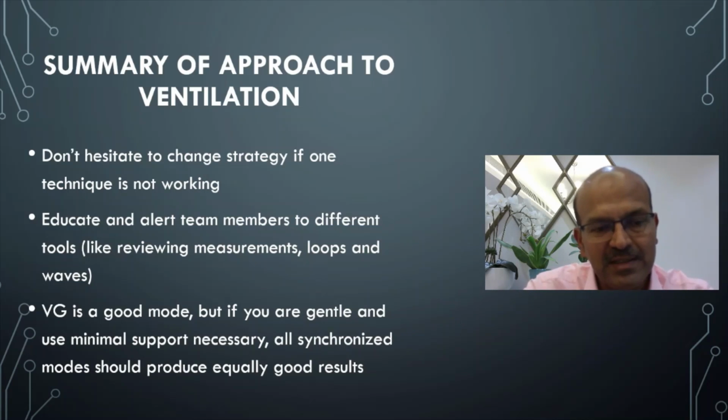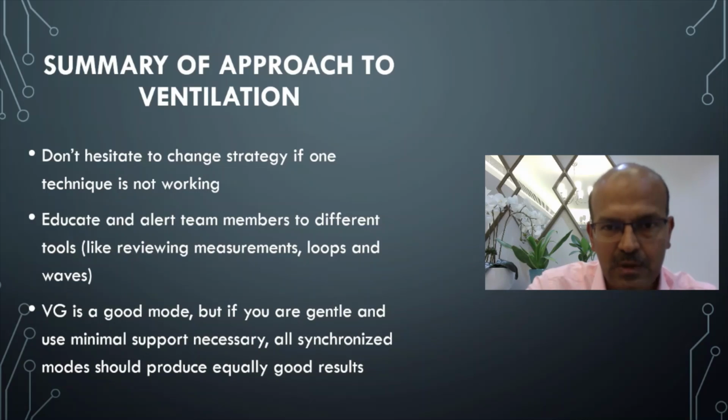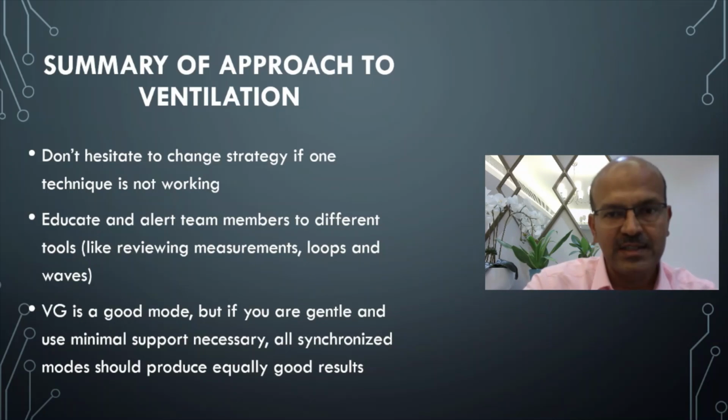So I hope this discussion has been useful to you and achieves your objective. I kept it simple intentionally because in real terms we are not going to use the flows and the waveforms to a great extent unless you are in trouble. But it's a good practice to review that during every round, and teach the nursing staff as well how to interpret and inform you if there are changes.